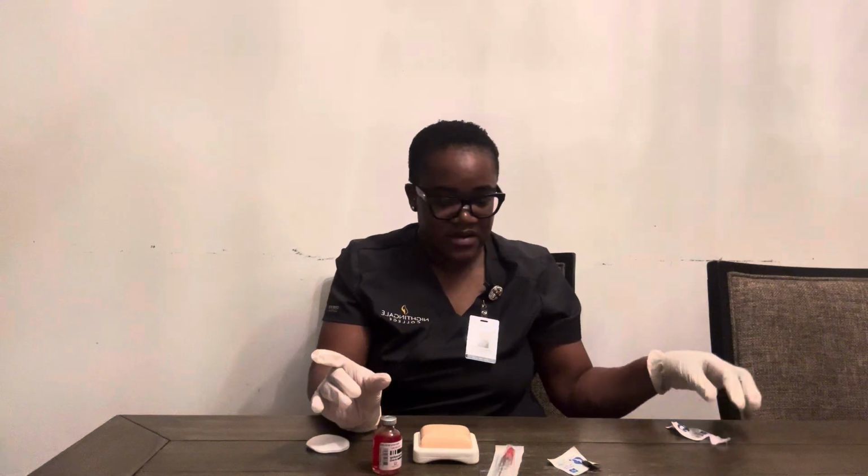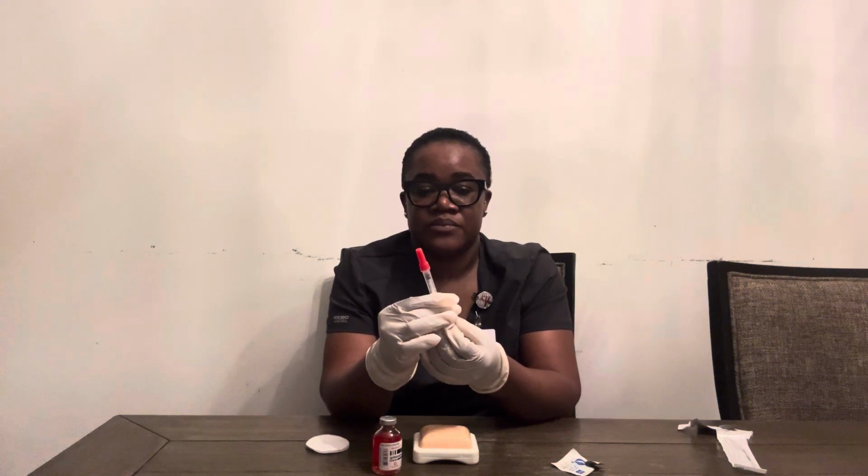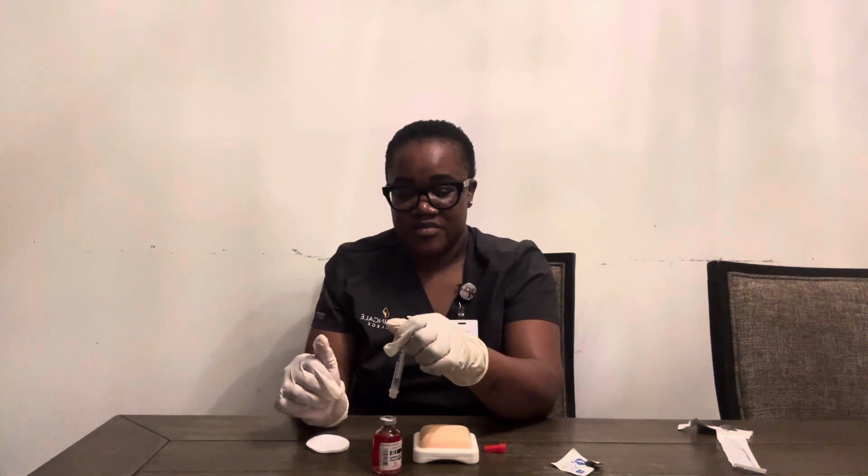And then I am going to take my needle, and then I am going to withdraw 0.1 ml of air. And then I'm going to uncap my needle, and then I'm going to inject this 0.1 ml of air in my medication.